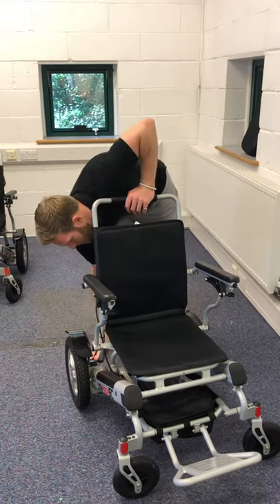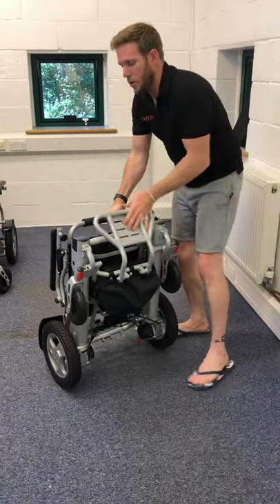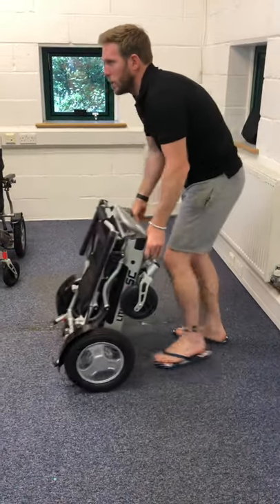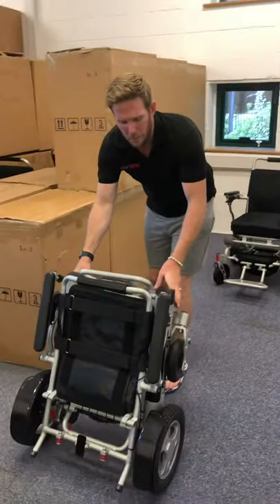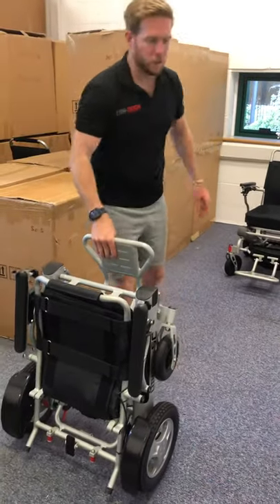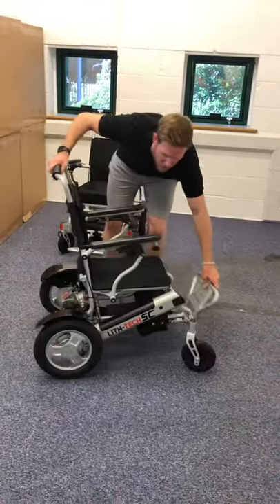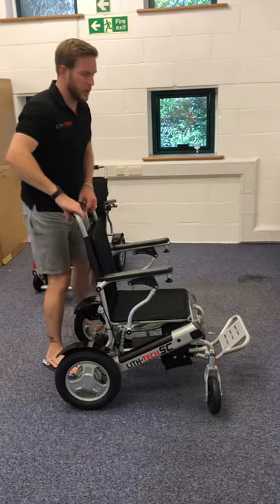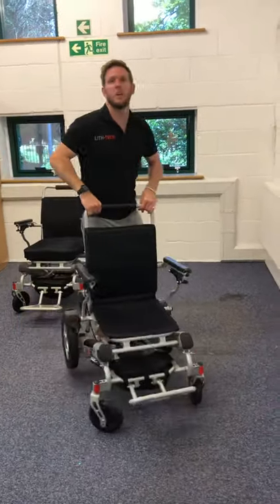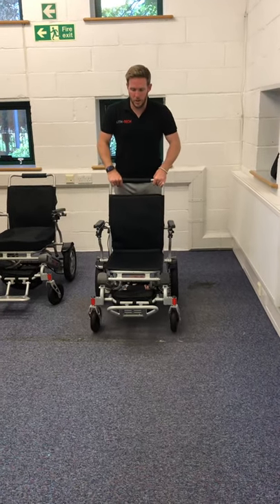Rather than lifting the chair to and from the car or down the hallway, you can simply roll it. If rolling forward it's easier pushed by the legs; if you want to tow it behind you like a suitcase, grab it from the foot plate. Although these chairs are very light for electric wheelchairs, they're still 23.5 kilos without batteries and 26.5 kilos with batteries.